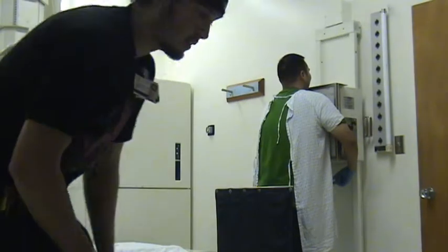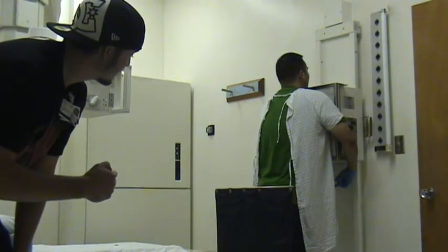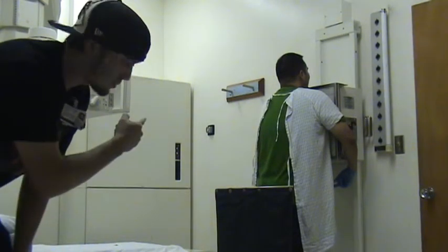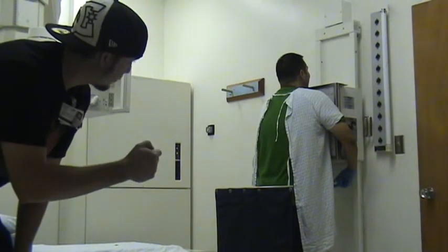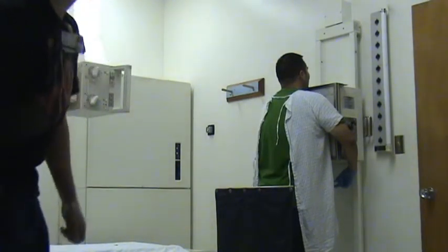Adjust it accordingly, and what we do is we're going to tell the patient to take in a deep breath, let it all out, take in another deep breath, and hold it. Zap. You make sure that as the patient is breathing and holding it in, you want to click while looking. That way there's no motion or anything going on. And go ahead and breathe, sir.